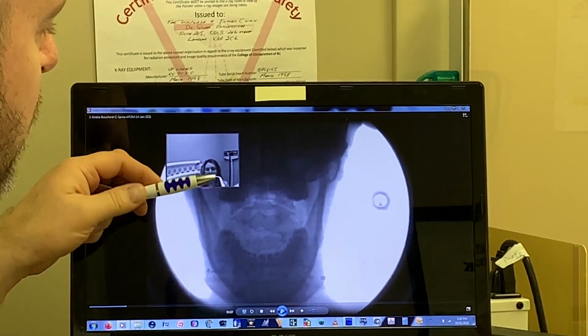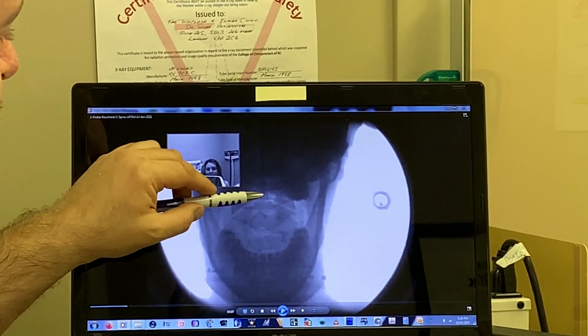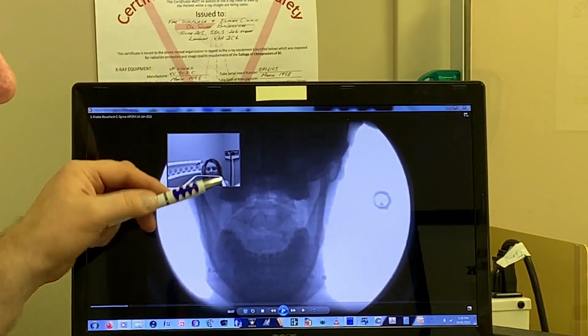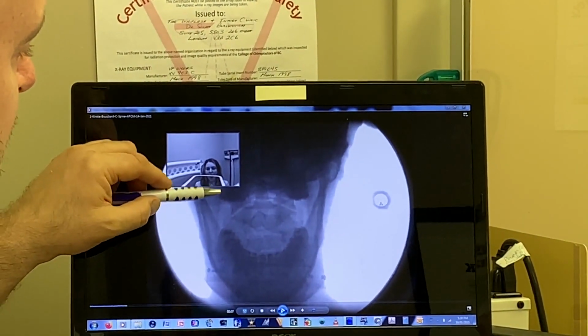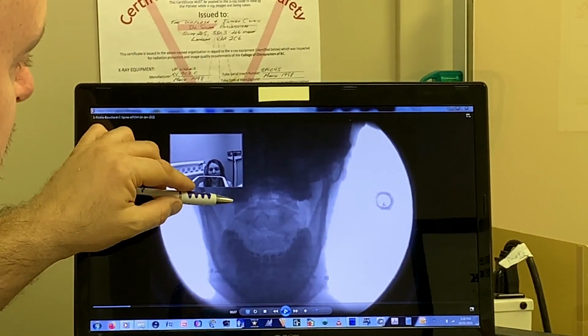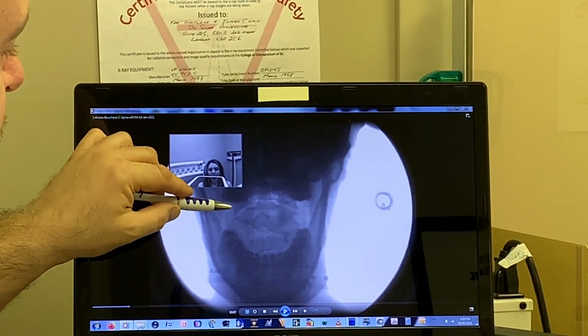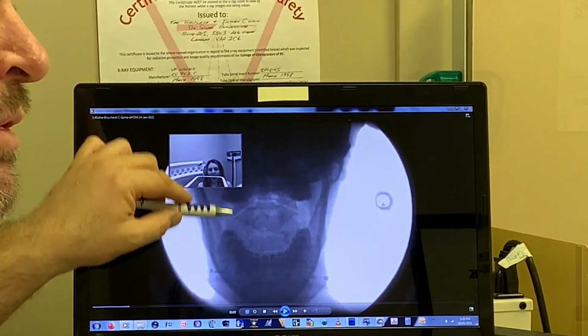And so when we're evaluating the movement, as you do the movement in a second here, I'm assessing to see if these spaces remain equally spaced. They should stay relatively equally spaced. And the additional thing that I look at on either side when you go to the left and to the right is that this side margin here of that block on the first bone and the side margin underneath that of the second bone stay lined up vertically.